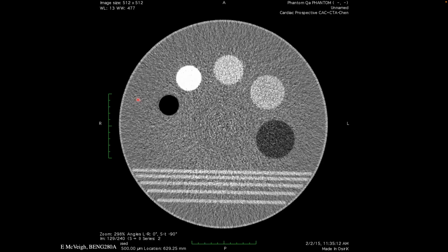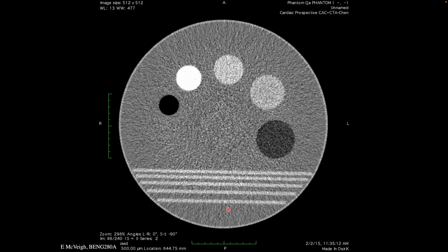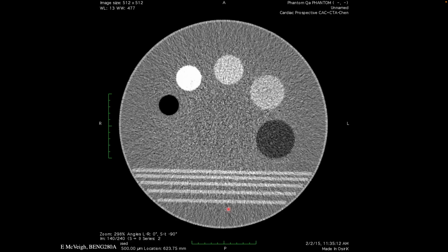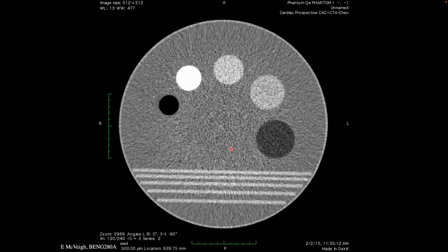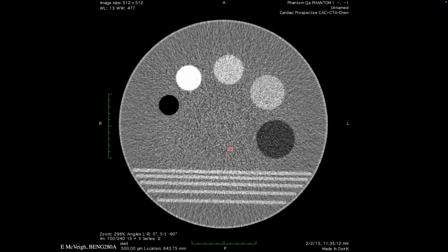And you can see that there are a lot of interesting radial artifacts going off at the periphery of the field of view. There aren't those radial artifacts here, but there is a maelstrom of higher noise pixels in the middle.